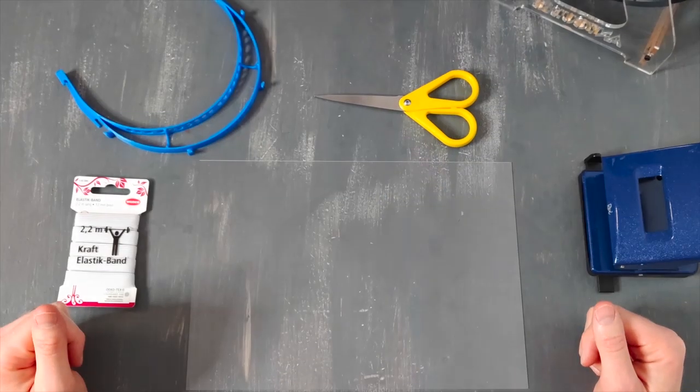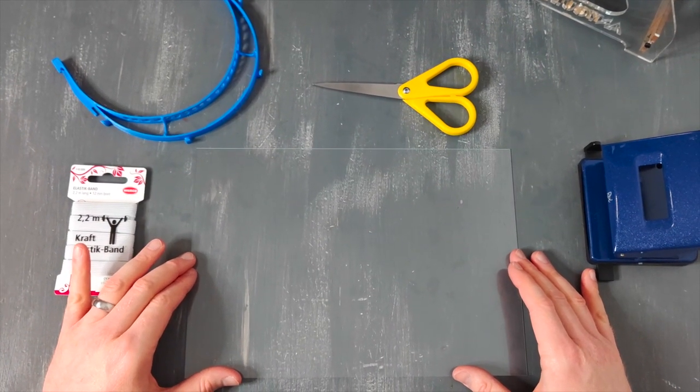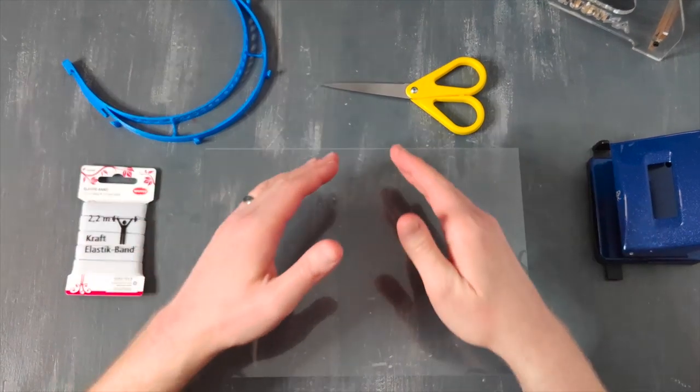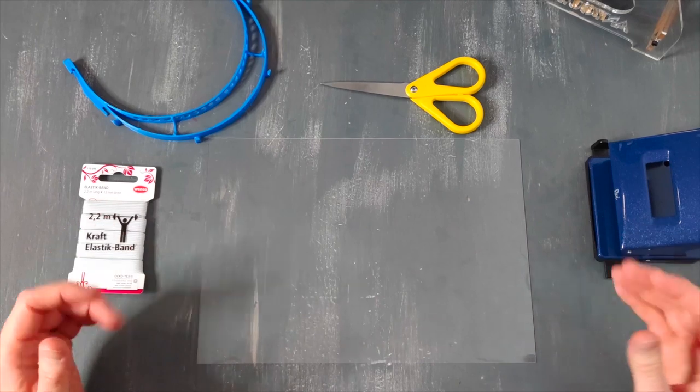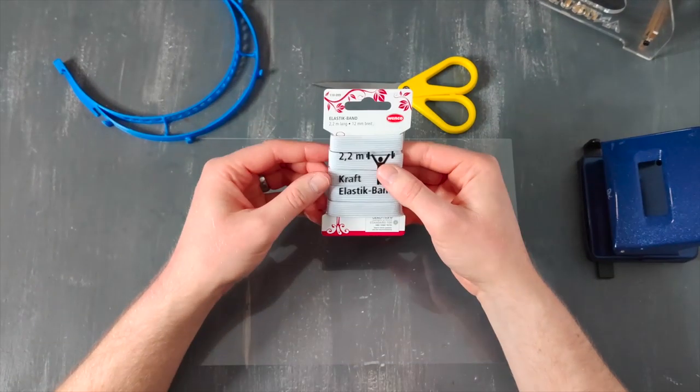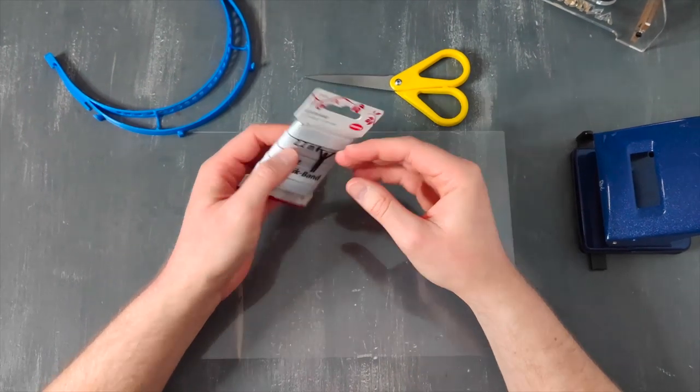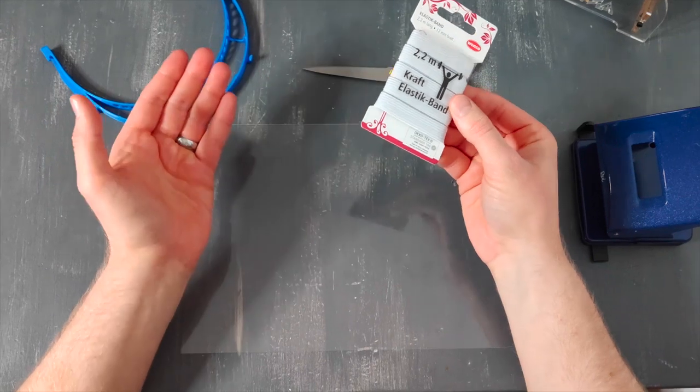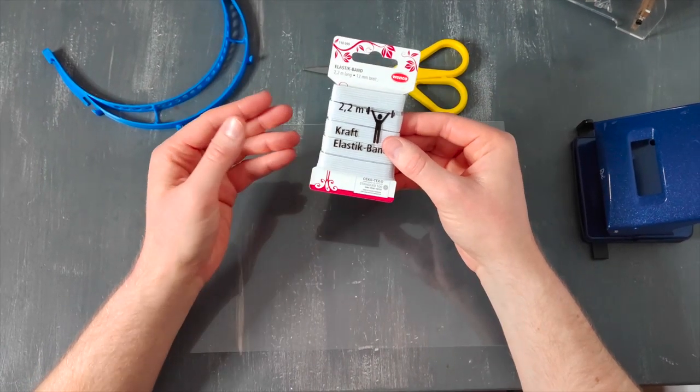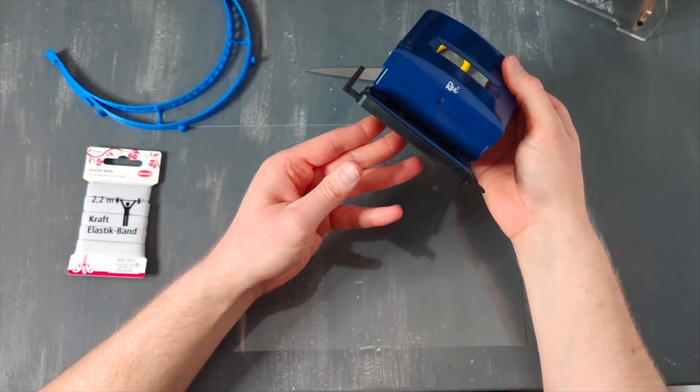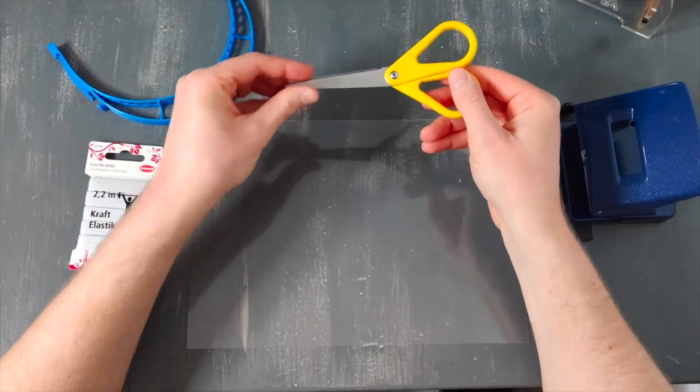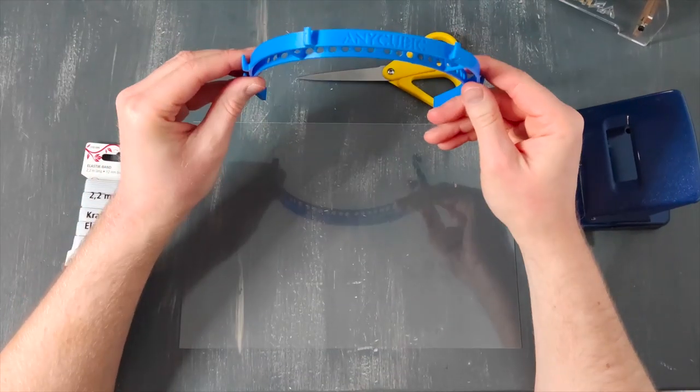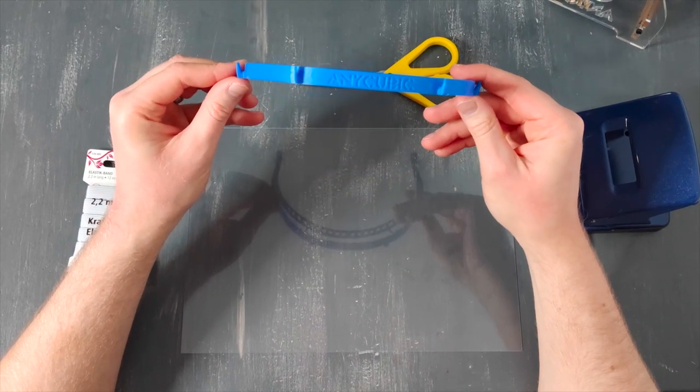What you will need is a PVC foil in 0.3 to 0.5 millimeter thickness, in the size of A4. You can find it in most common grocery stores or on Amazon. You will need elastics, an elastic band with the width of 1 to 2 centimeters. You can also find it on Amazon or in grocery stores. You will need a hole puncher in a regular size, some scissors, and the printed frame for the face shield that we provide on our website.